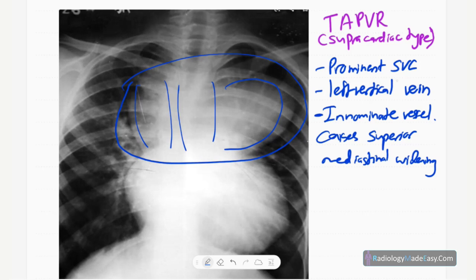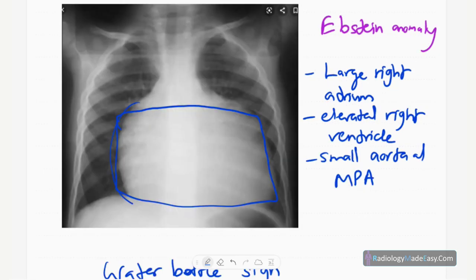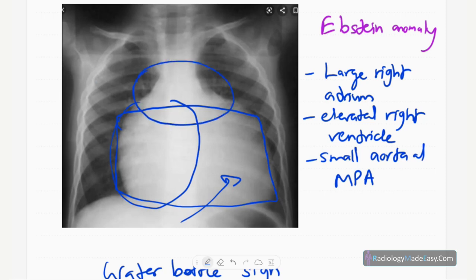Next is the box-shaped heart, seen in Ebstein anomaly. In Ebstein anomaly there is atrialization of the right ventricle, causing gross enlargement of the right atrium. The right atrium pushes the right ventricle upwards. There is also a small aorta and pulmonary artery, so the superior mediastinum is relatively narrowed, giving the box-shaped appearance.